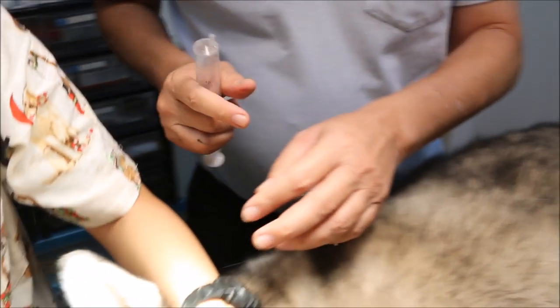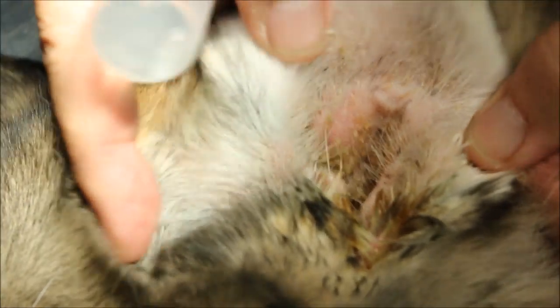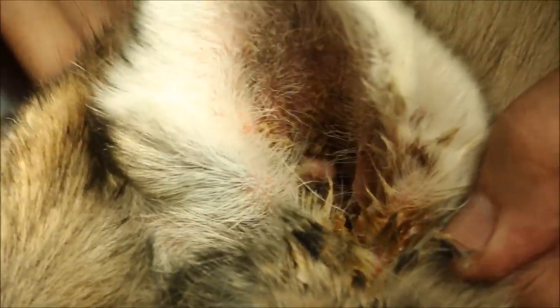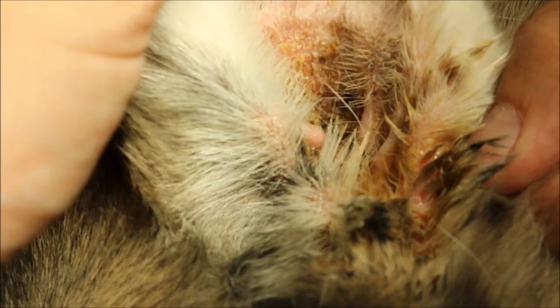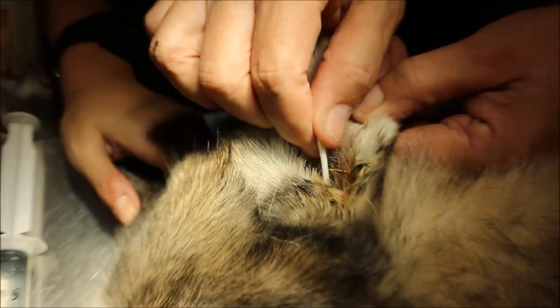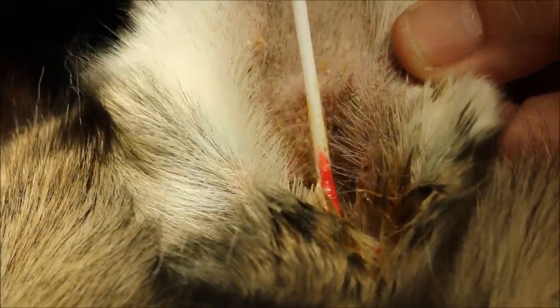At 2% maintenance, we demonstrate the procedure. The ear is pretty bad — this case has been going on since five years ago when I first did ear irrigation. The owner treated it with occasional ear drops but it got worse. You can see the ulcers and the pus. It would be very painful without the anesthetic — you can even see blood. The right ear is similarly painful but we are doing the left ear first.